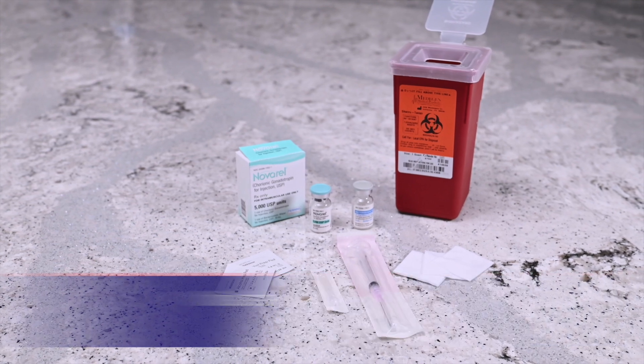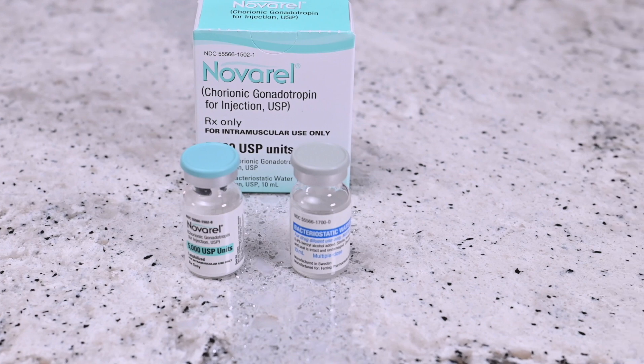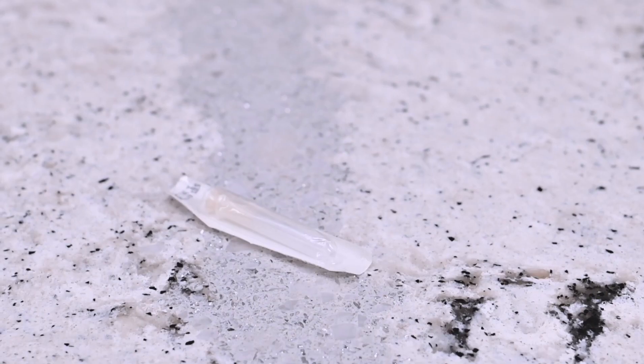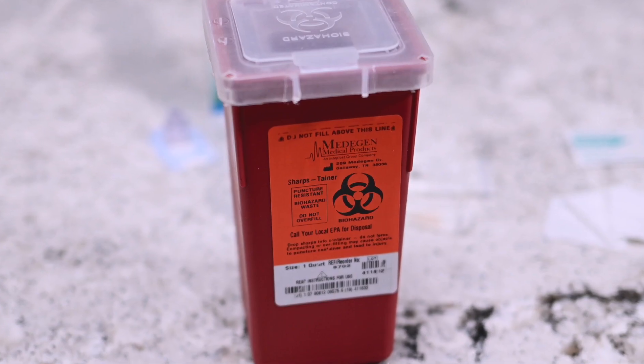You will need the following: vial of Novarel powder, vial of Novarel solvent, syringe with attached needle, subcutaneous needle, alcohol pad wipes, gauze, and sharps container.